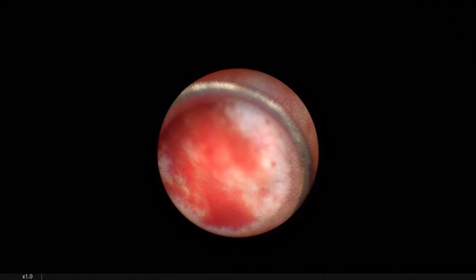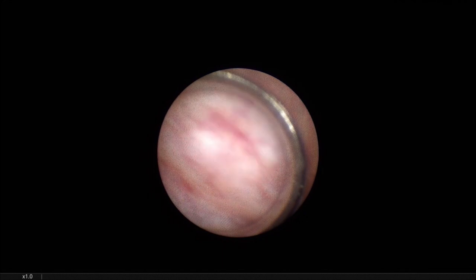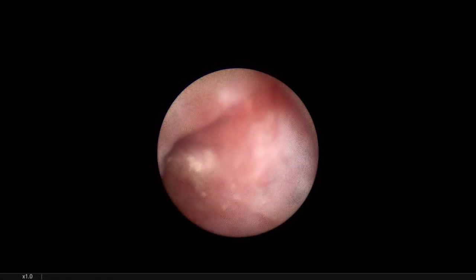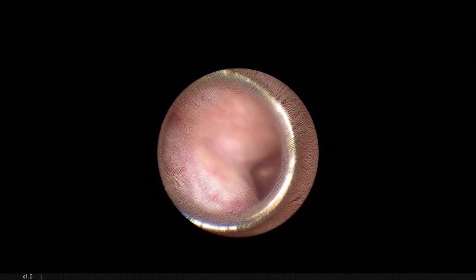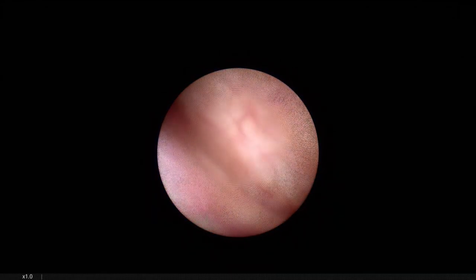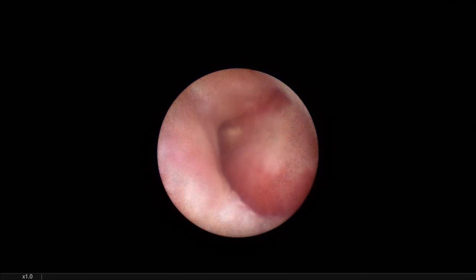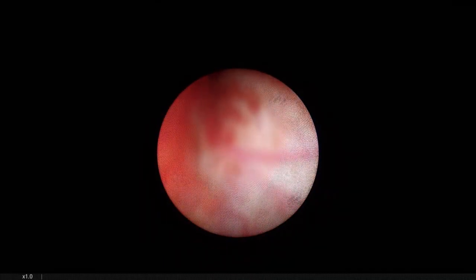And probably stones are located here, I'm not sure. Okay, there's the other part of the lower calyx. No stone so far. So far, so good. This is one of the good sides if we had a transparent sheath. Unfortunately, they are very expensive, a transparent sheath.